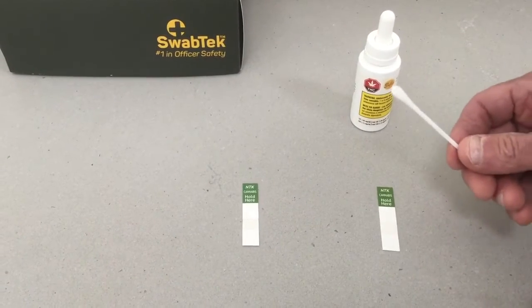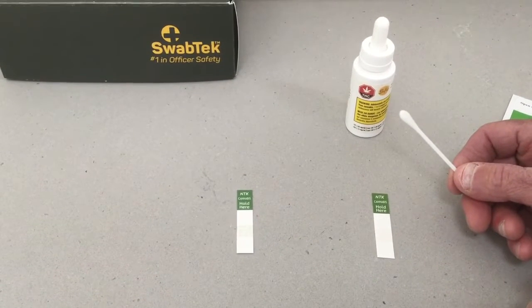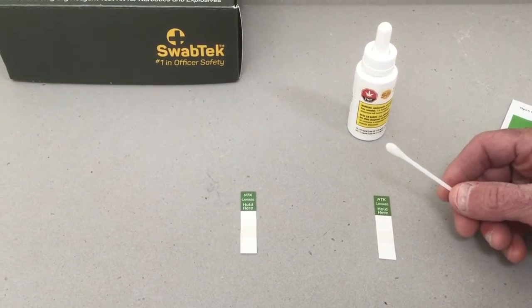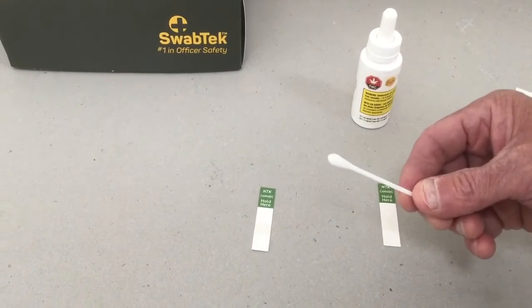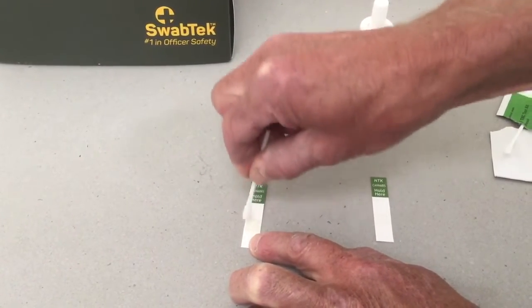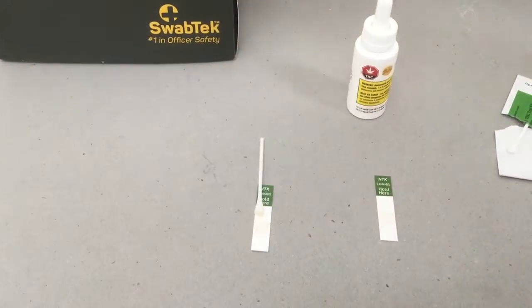In this demonstration, we're going to look at cannabis products. Now, with any of our test kits, if you're ever unsure as to the exact type of positive, what is a positive indication, it's always good to do a true negative, meaning just obtain the strip and the swab for whichever test it is, and knowing that you've got absolutely nothing on there, just see what it does, and we can then compare it afterwards. So there's a true negative result.